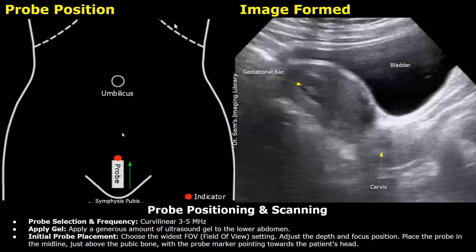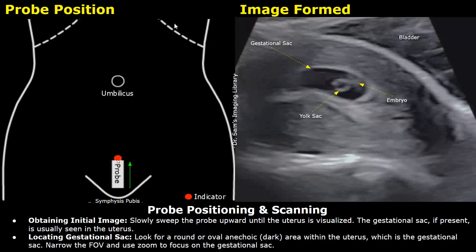Slowly sweep the probe slightly upwards until the uterus is visualized. The gestational sac, if present, will be seen within the uterus. This is the gestational sac with anechoic fluid — it is a round anechoic area within the uterus. After locating the gestational sac, you can narrow the field of view and use the zoom to focus on it.